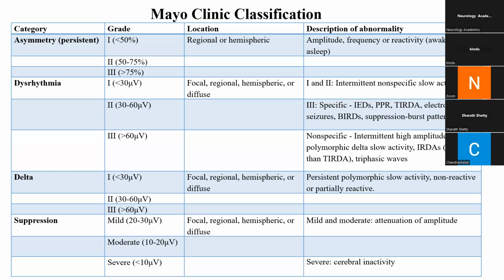They should know all this physics. This is what the technologists should know in more detail. Not that these people shouldn't know, but for you it is much more important. Anything else?